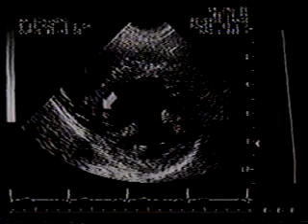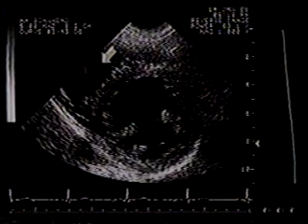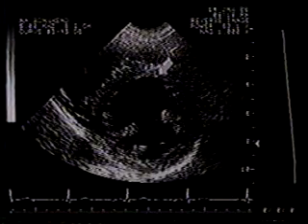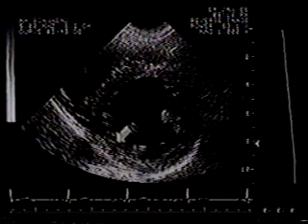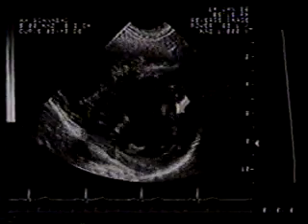The ventricular septum lies between the left and right ventricles. Note that the right ventricle is incompletely visualized. In addition to the septum, the left ventricular segments include the anterior, lateral, and inferior walls. In real time, note the uniform contraction of all left ventricular segments.